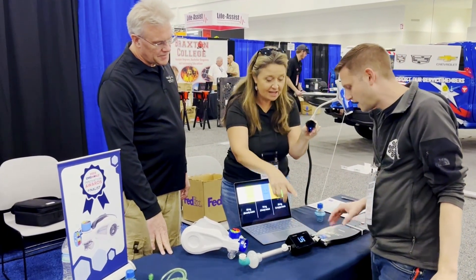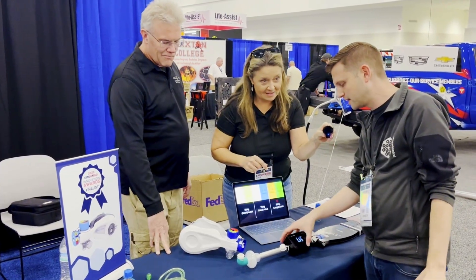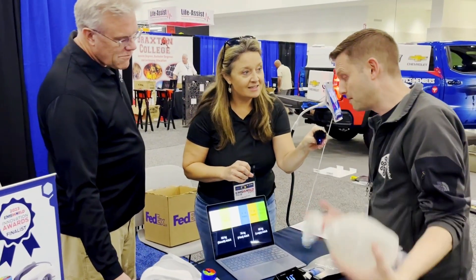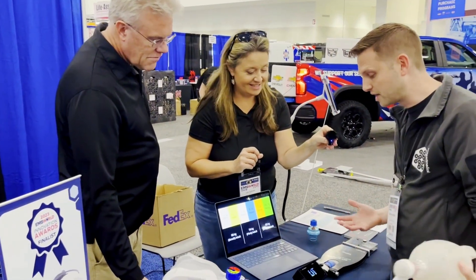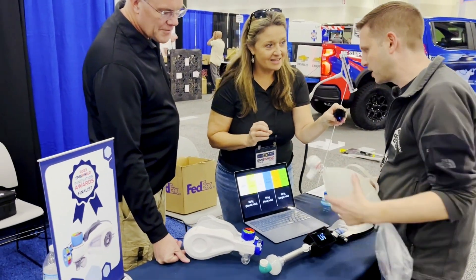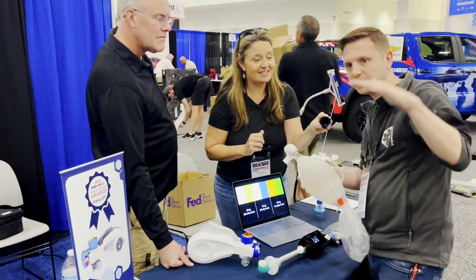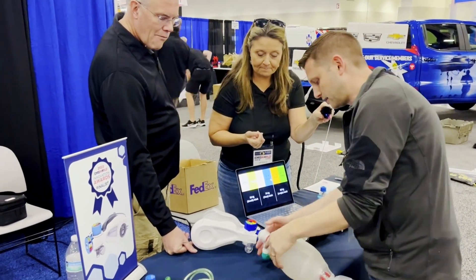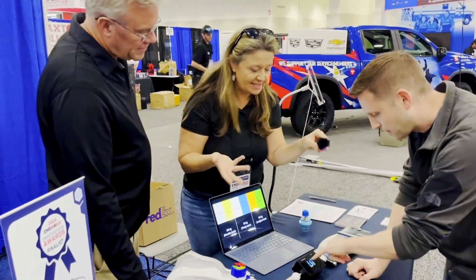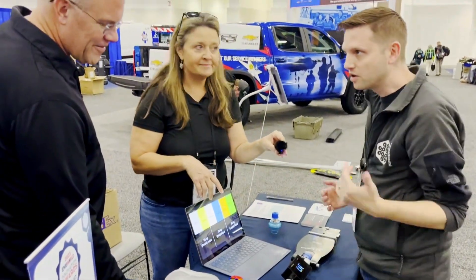This is fantastic — you spent a ton of money on this device. This is an IMT Analytics test lung and analyzer; they use this to calibrate ventilators professionally, like in hospitals. It's a highly accurate machine. We tell people: how many times have you seen someone on a run resuscitating a petite adult female and somebody just squeezes the bag like this? Our tidal volume there is 973 milliliters — a huge amount of air.